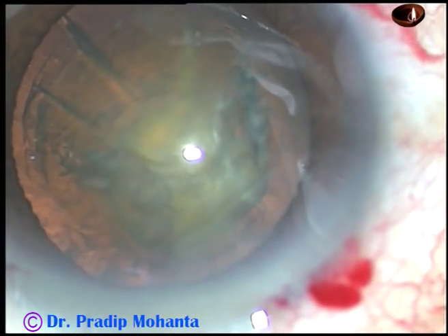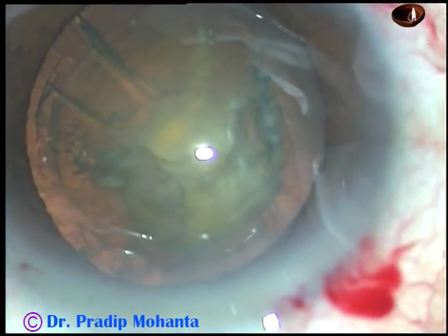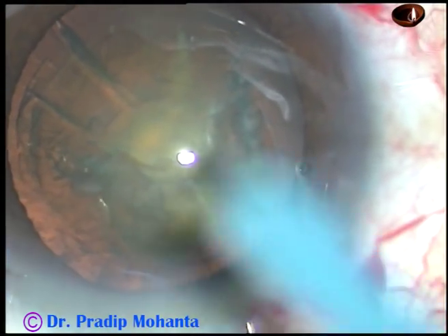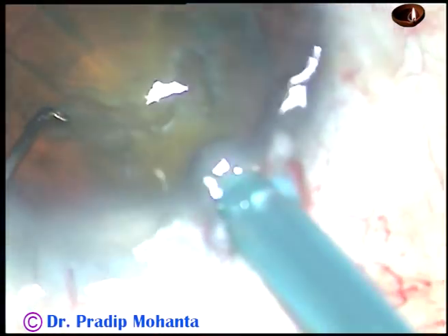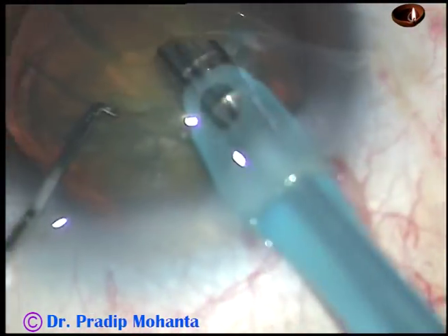I am not going to rotate this nucleus. I want to manage the nucleus over the epinuclear shell, over the epinuclear cushion.